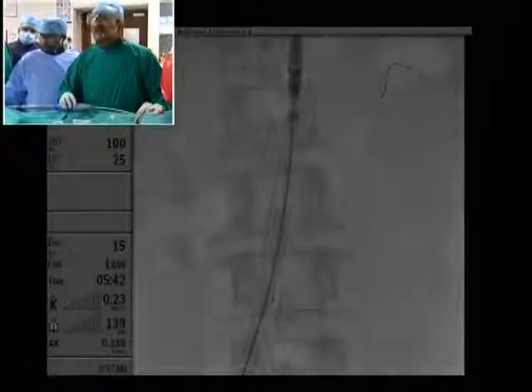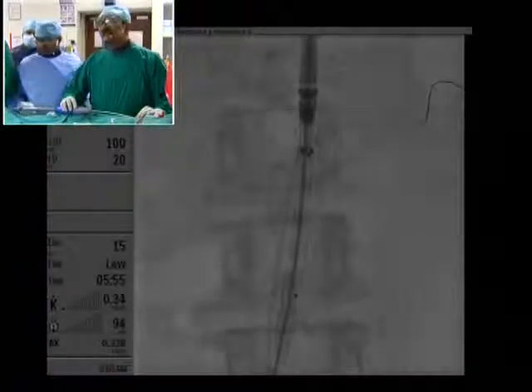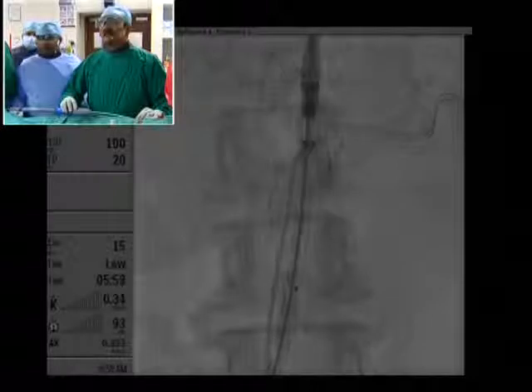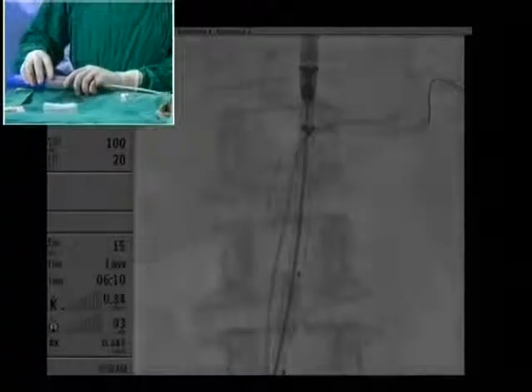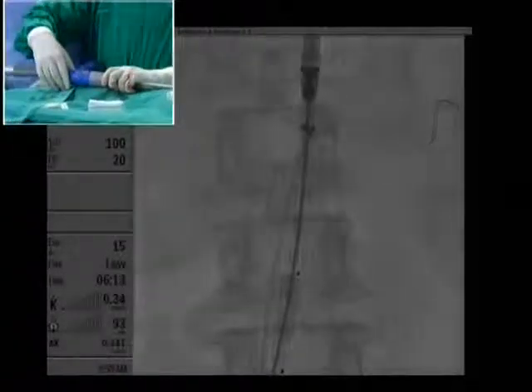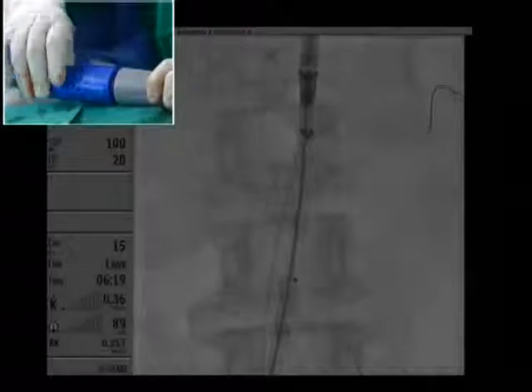Now we'll look at the top. At the top I'm almost at the right place. Can we have one mag there? And center that renal. Yeah, that's it. Okay, a small test there, please. You can see that the catheter has come down a bit. So I can actually go up till here. Test again. Yeah, so this should be all right. So I'm beginning the release. We can do a slow release by just rotating this blue knob anti-clockwise.